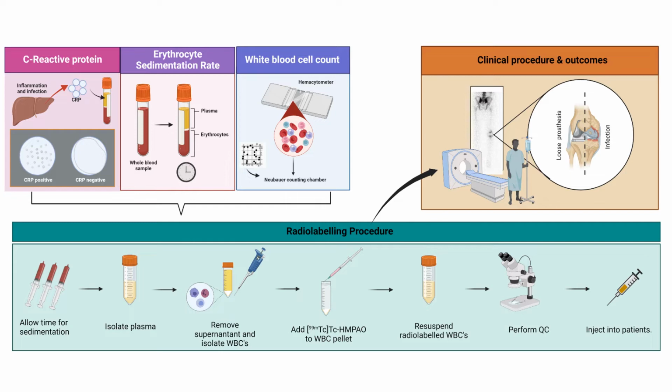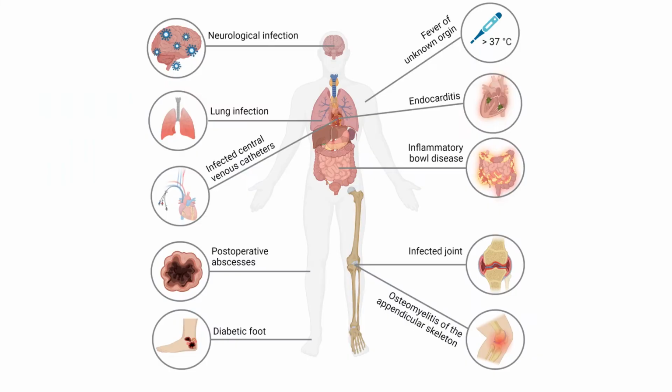Most of the time we look at leukocytes, but you can also split up the different white blood cell groups and just image a particular one. That is just a more laborious procedure.